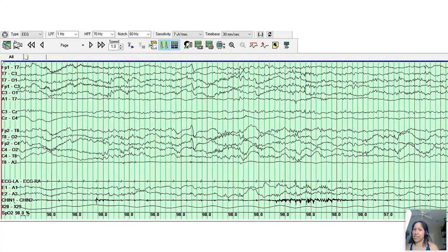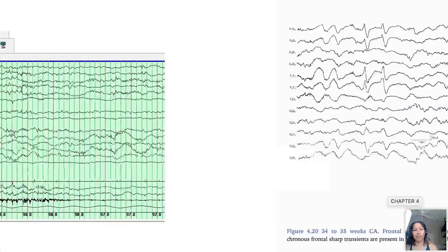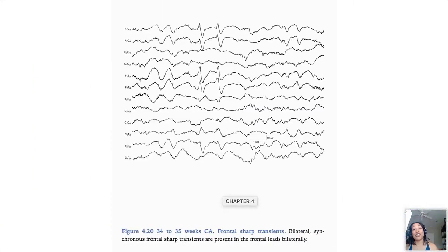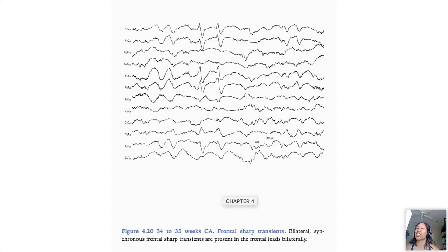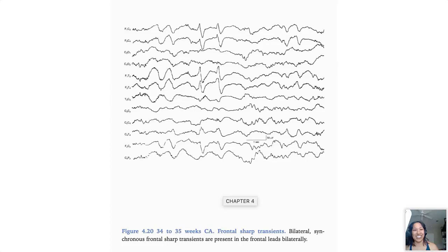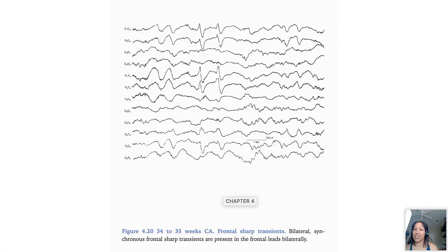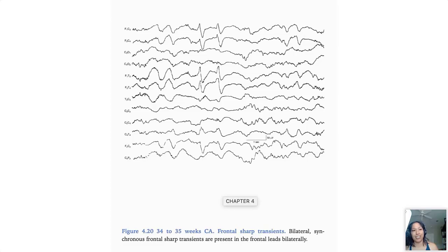We have one more example, this is in the same EEG, the same 36 weeker. So, you know, if this was an adult study and we were to see these, it'd be like 'wow that's kind of sharply contoured, maybe we need to see some more examples of that, maybe we need to see if that's epileptiform.' So it turns out in neonates this is normal. We call these encoches frontales because once again all of this is in French, but we call these frontal sharps in English, and these are a normal grapho element seen in neonatal EEG.